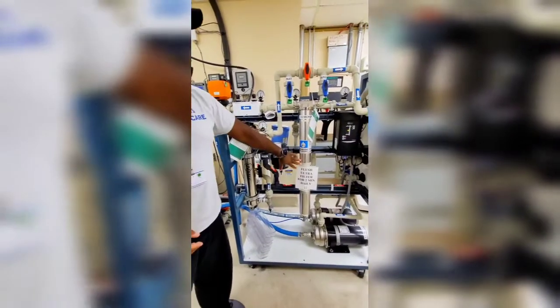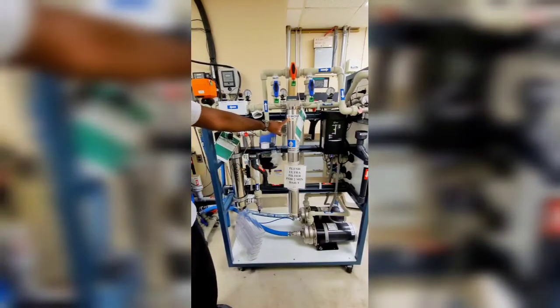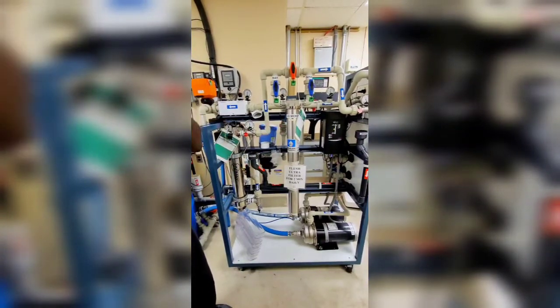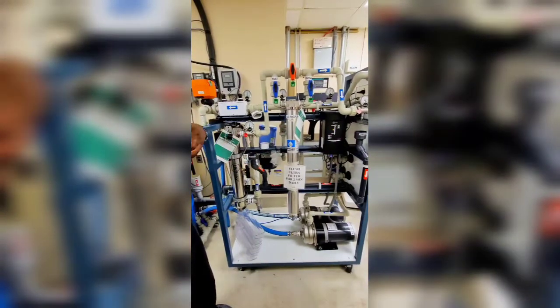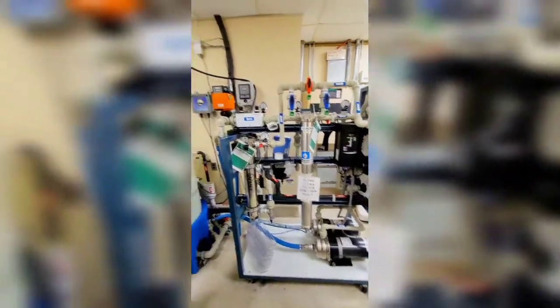Goes through here to an ultra filter — again taking out anything that might still be in that water. The lower the micron, the smaller the particles it's able to catch before it goes through. Goes through there and then gets to the floor.